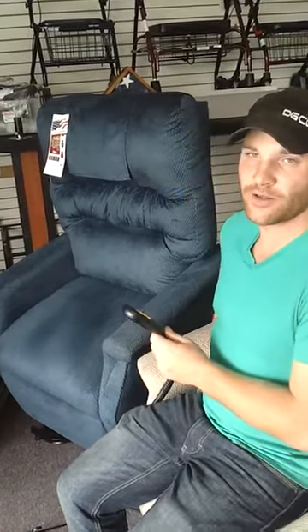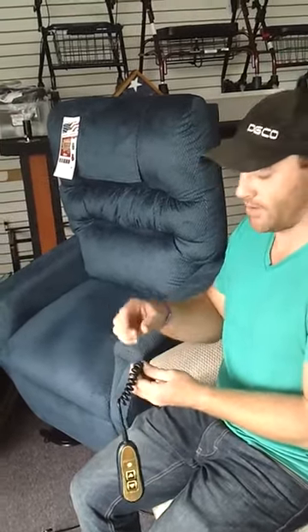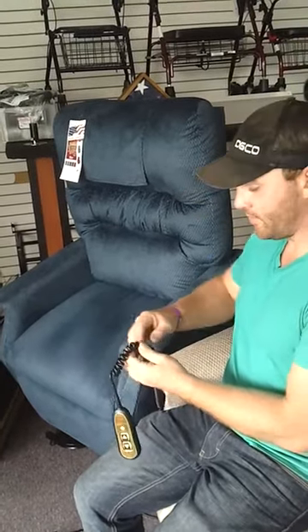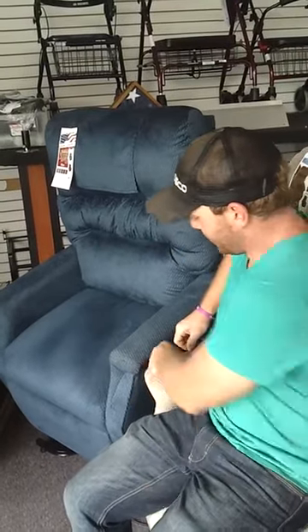There's a hook on the side on most of them. I prefer to take a safety pin — a bigger safety pin — loop it into the side of the chair right here and loop it into the controller so it's always on your side and never hits the ground. You always have it right beside you.